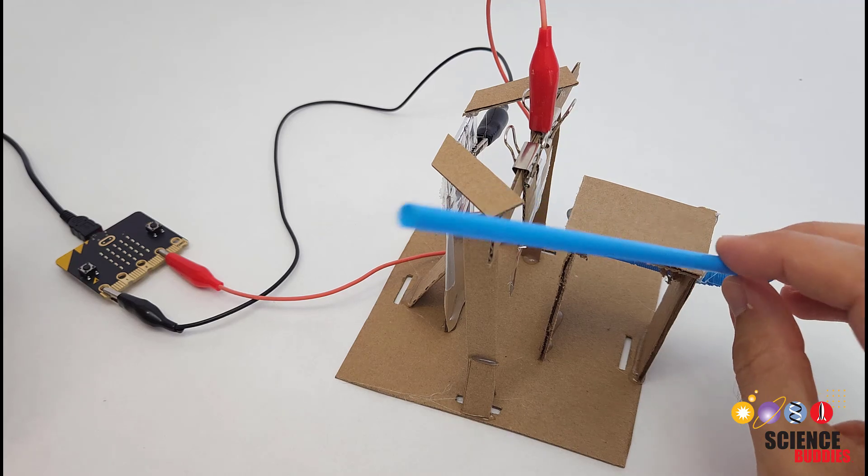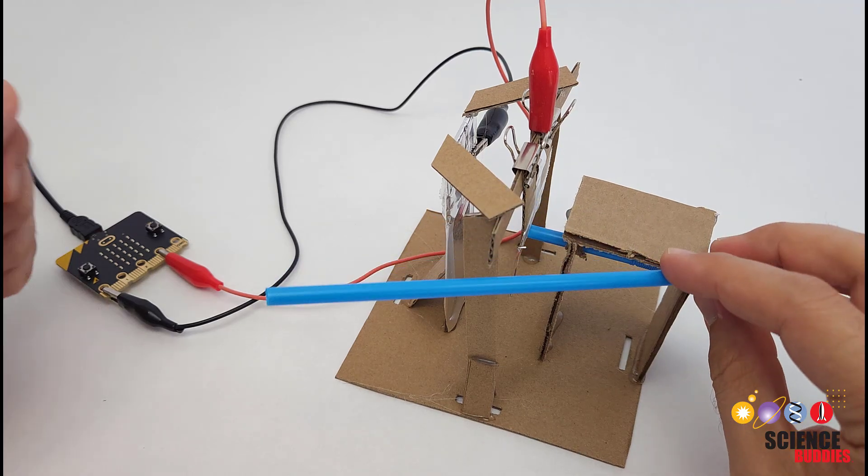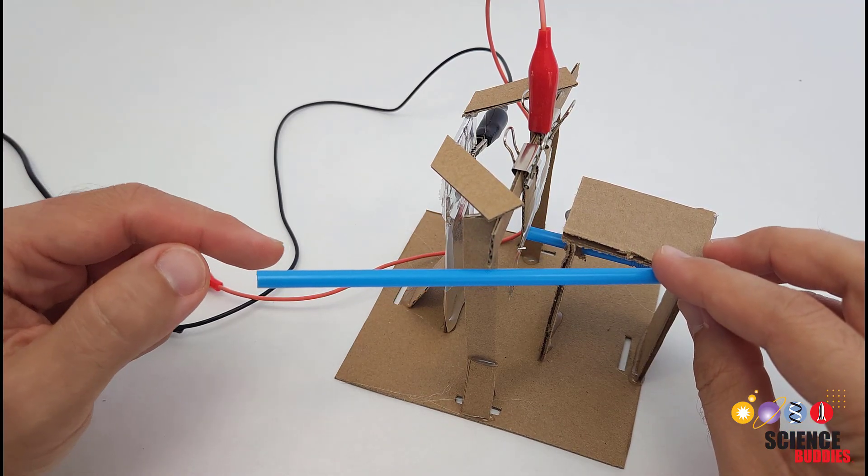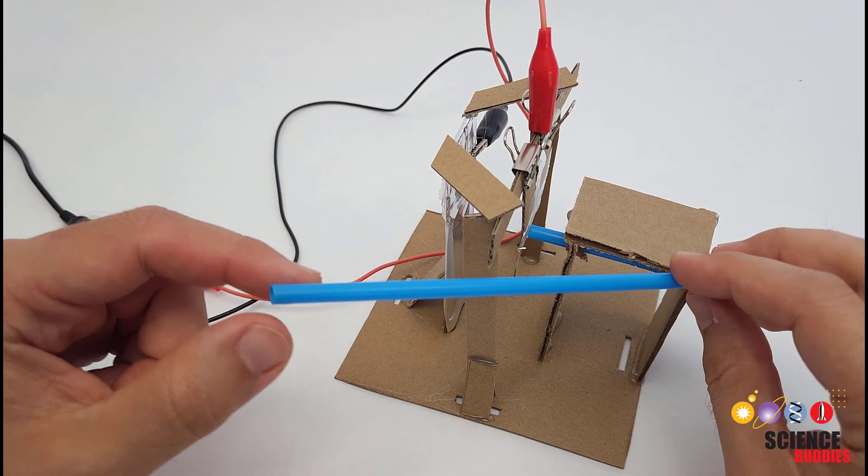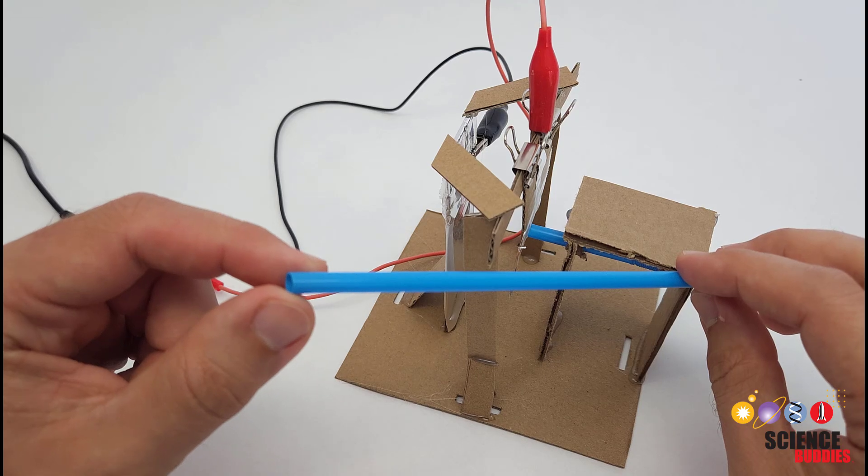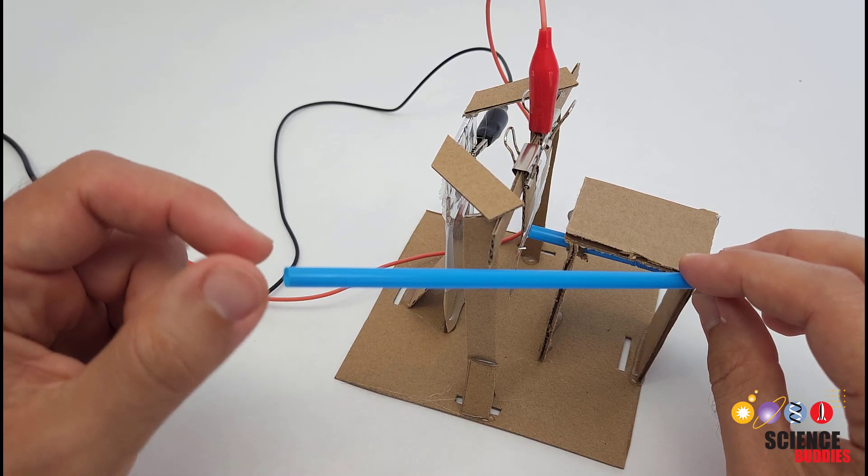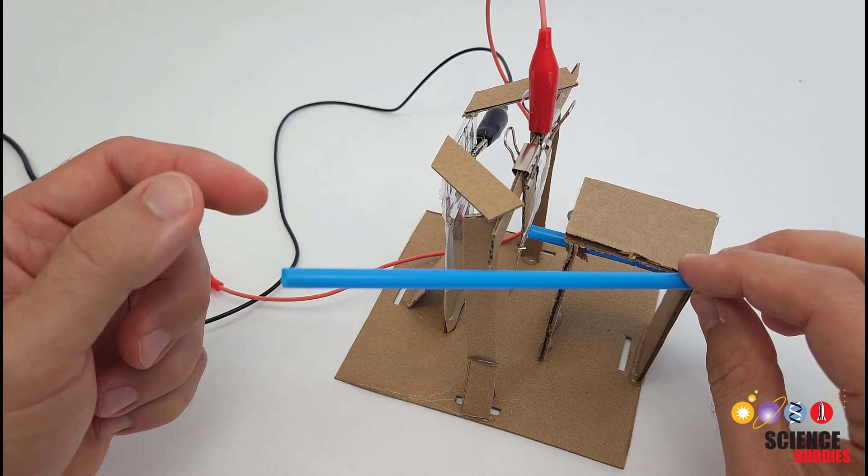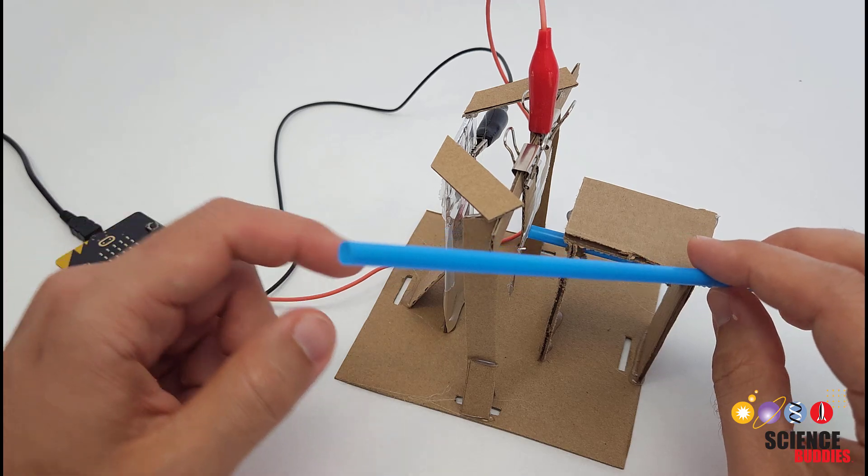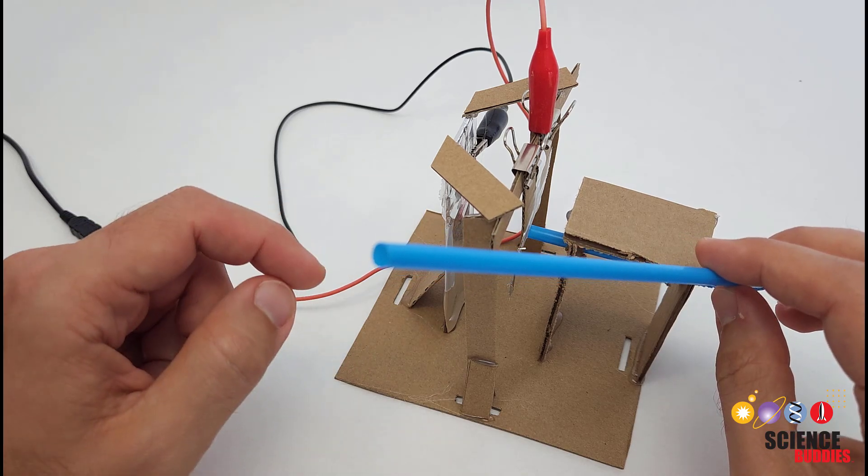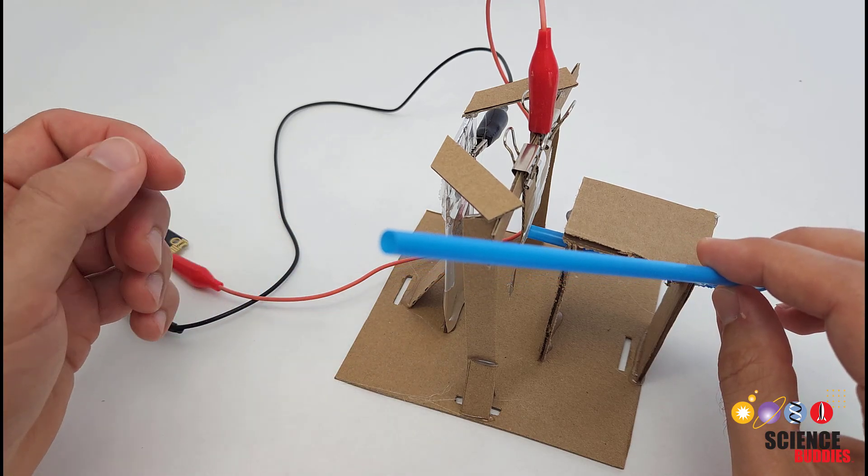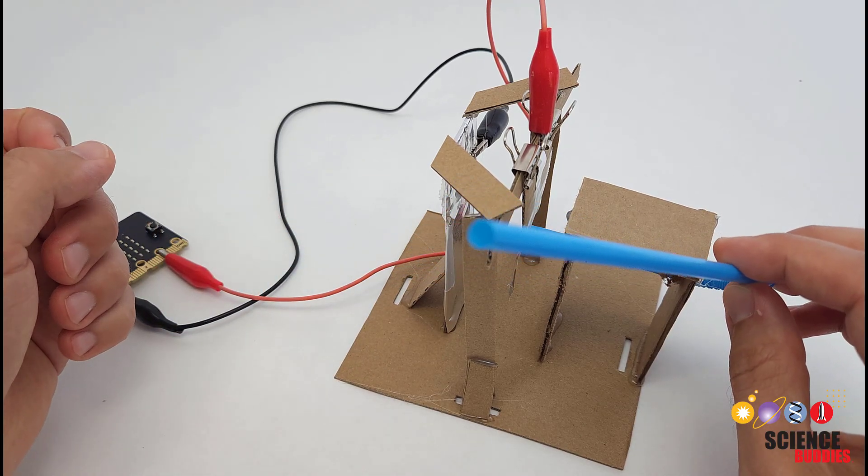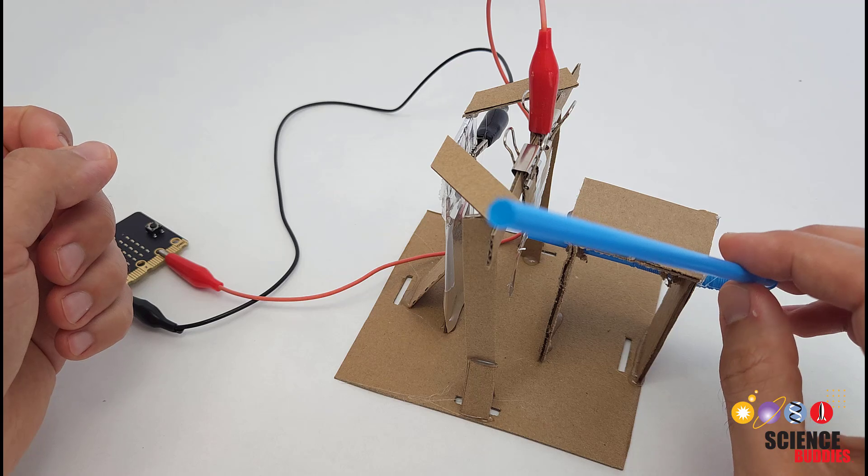This is a prototype puff switch, an electronic switch that I can control without using my hands just by blowing into this straw. People who have trouble using their hands to push buttons or use joysticks can use puff switches to control things ranging from motorized wheelchairs to phones and computers.